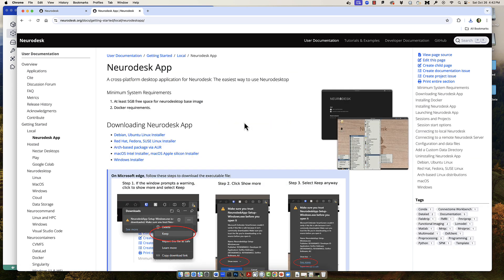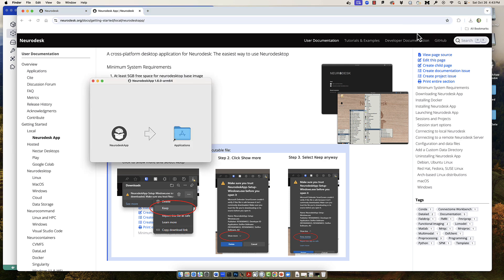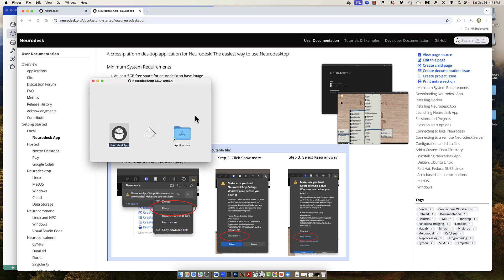Click on the link appropriate to your machine — in my case, the Mac OS Apple Silicon installer. Wait for it to download, and then just like with Docker, open it up and make sure it's running.